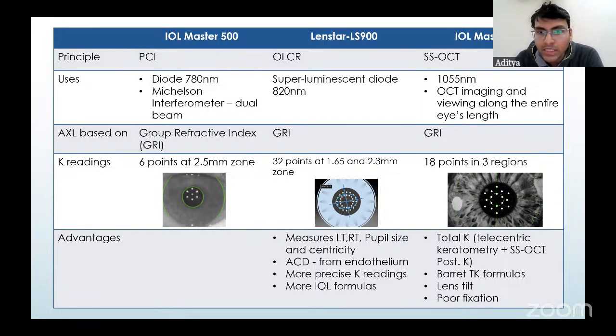Coming on to other advantages, as we know that it images and views along the entire eyeball length. So it can help in letting us know about the lens tilt and the poor fixation if the fovea is not focused.